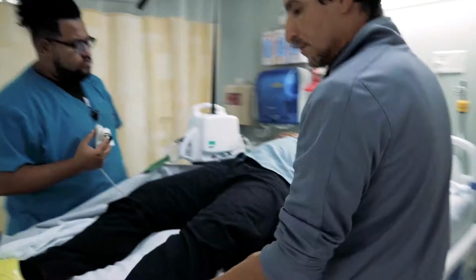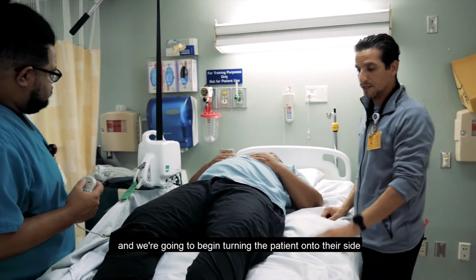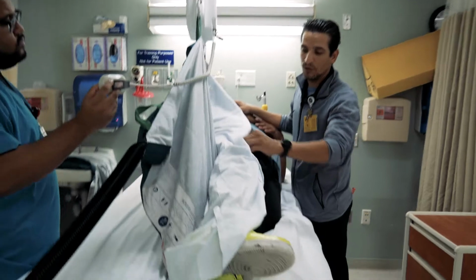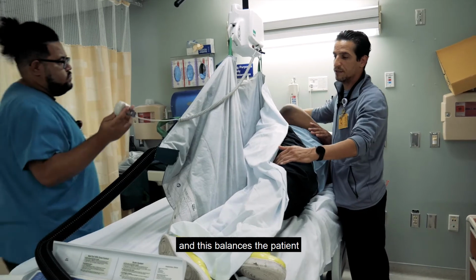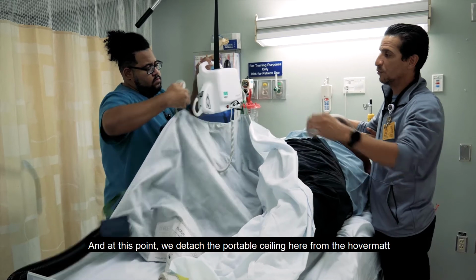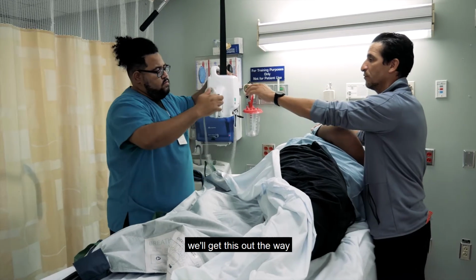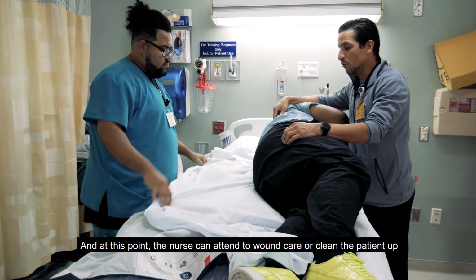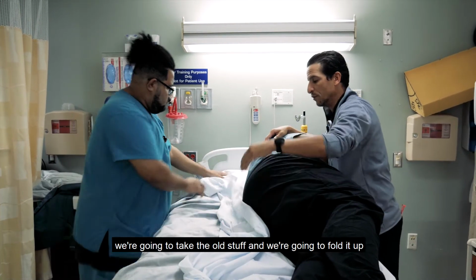So the next step here, I'm going to just slide the patient's leg to the center a little bit, and we're going to begin turning the patient onto their side. To balance the patient, all I'm going to do is slide the patient's leg forward a little bit, and this balances the patient. So now he can lower the ceiling lift there. And at this point, we detach the portable ceiling lift here from the hover mat. We'll get this out the way, and at this point the nurse can attend to wound care or clean the patient up. Once we're done cleaning, we're going to take the old stuff and we're going to fold it up.